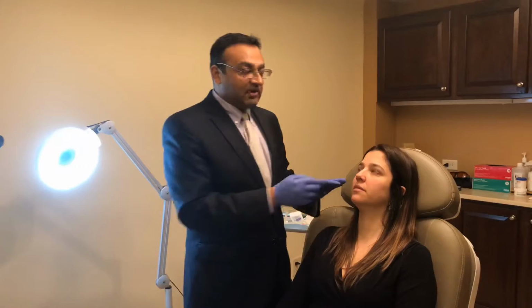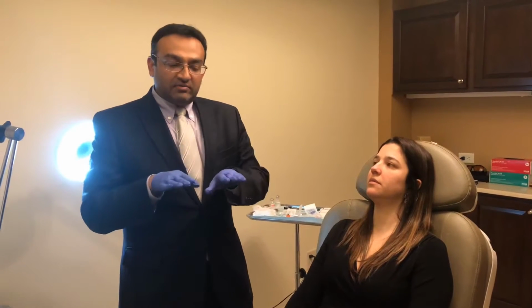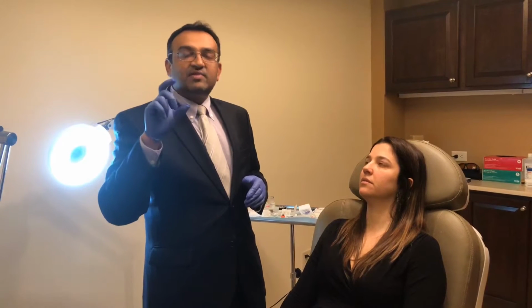So her primary concern is that she has hollowing over here, and this is when fillers are able to be utilized to basically plump up that area a little bit so you're not seeing that shadow that forms that's responsible for the dark circles. This is a very quick procedure. It takes about 5 minutes, and rather than using needles, over here I tend to use cannulas, which are kind of like needles but the tips are blunt instead of being sharp, so they tend to cause a lot less trauma to the skin, a lot less bleeding.